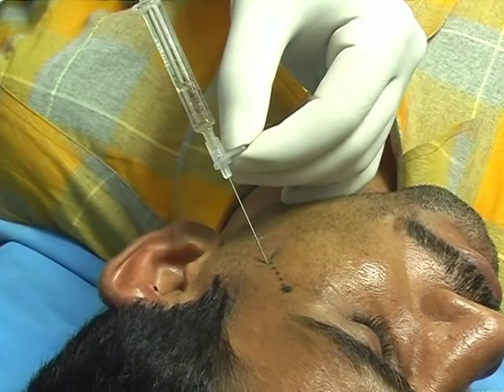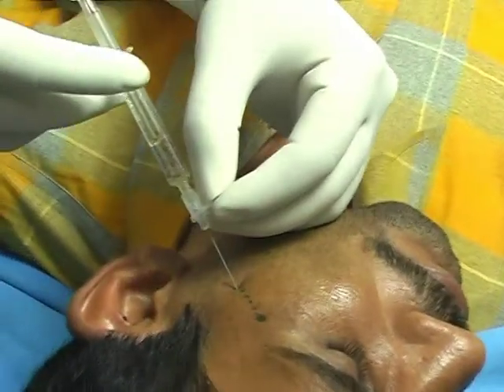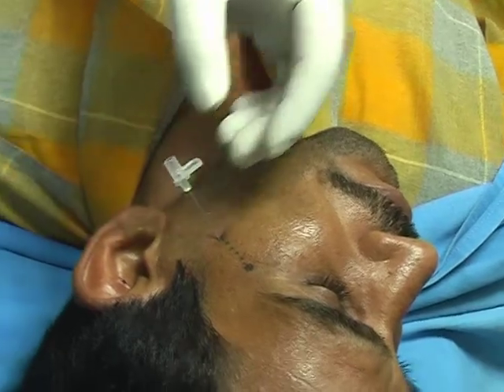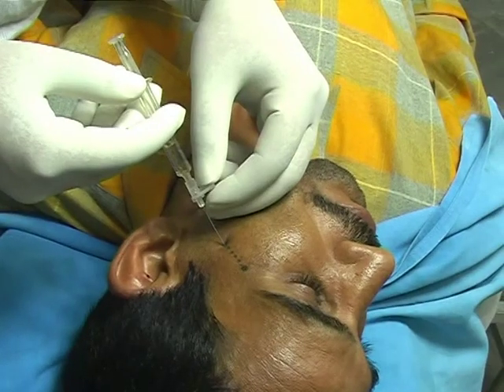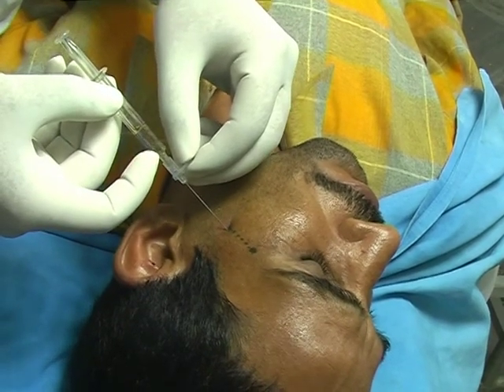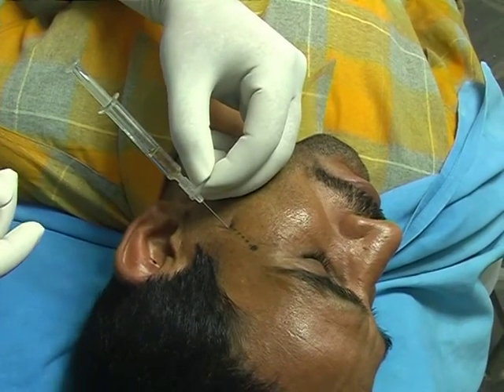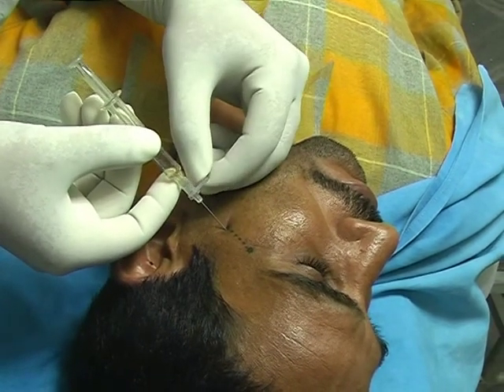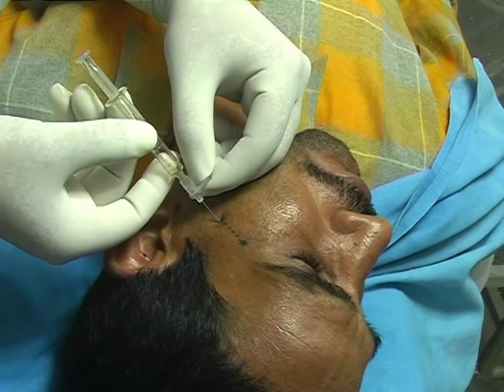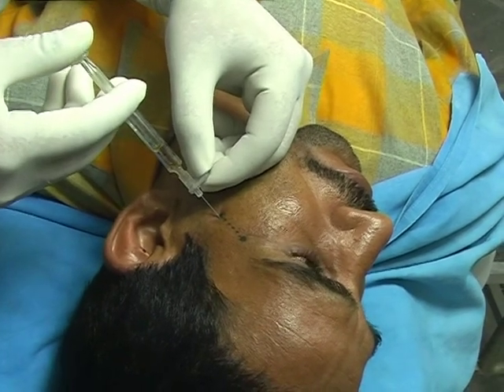I am inserting the needle — it is going easily, easily — now it has hit the bone. I am withdrawing the needle, now I am reaching near the pterygopalatine fissure. I have reached that place and there is no resistance.